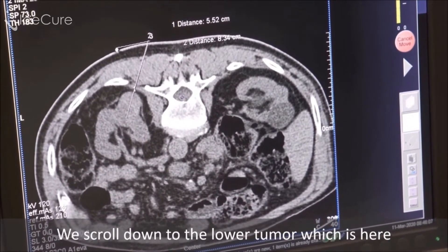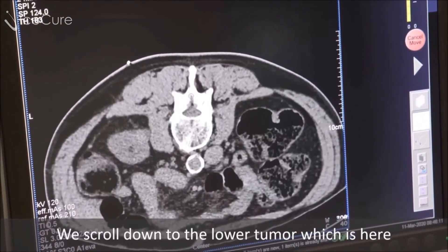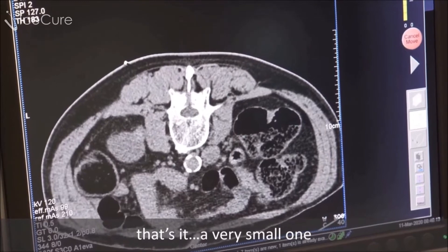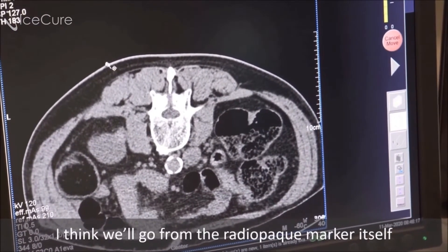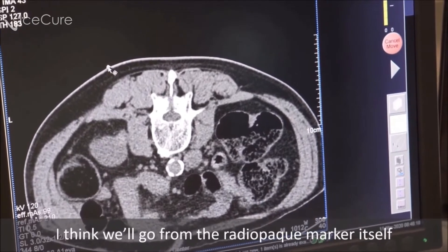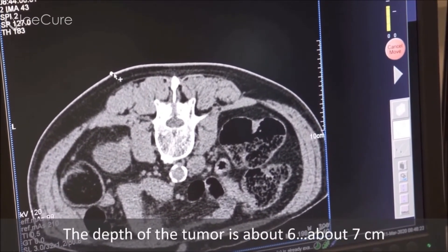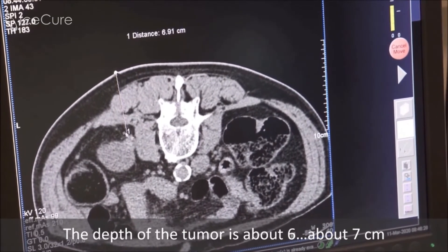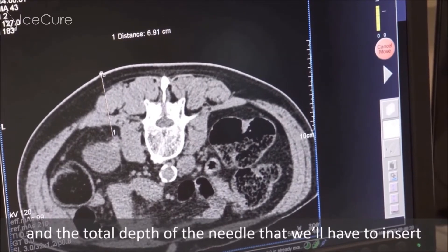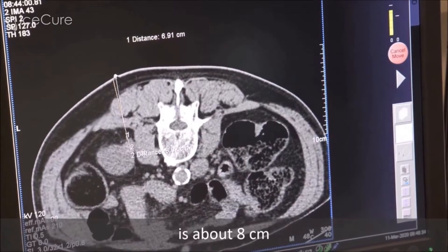We scroll down to the lower tumor, which is here — a very small one, also quite accessible. I think we will approach from the radiopaque marker itself. The depth of the tumor is about six to seven centimeters, and the total depth of the needle that we will have to insert is about eight centimeters.